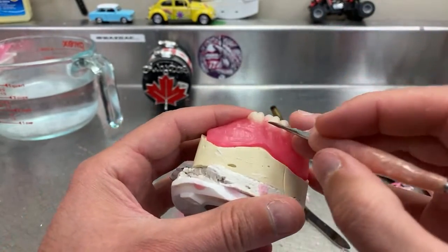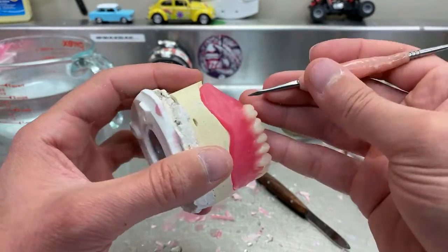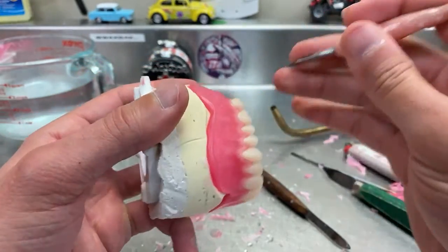This tooth here is actually going to need just a little bit of build up here. I will do it later, but for now, because I don't want to take too long.